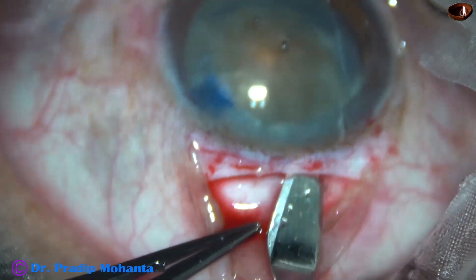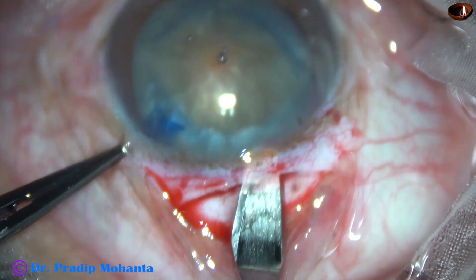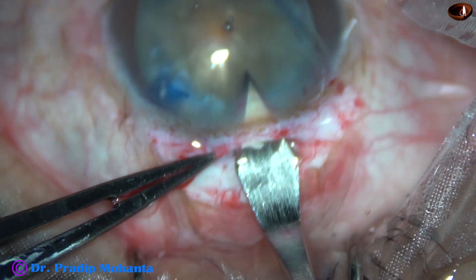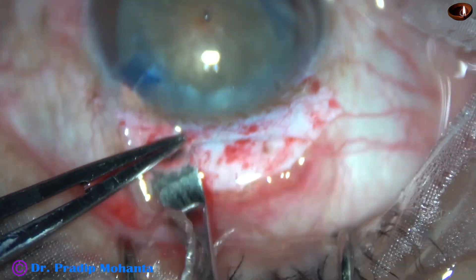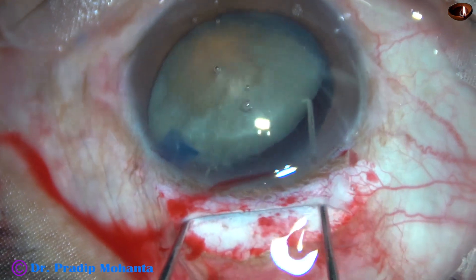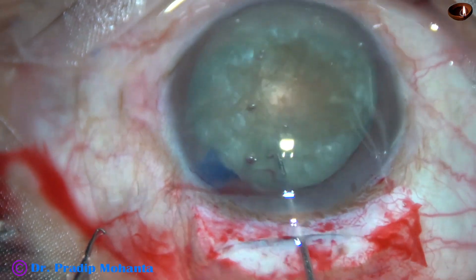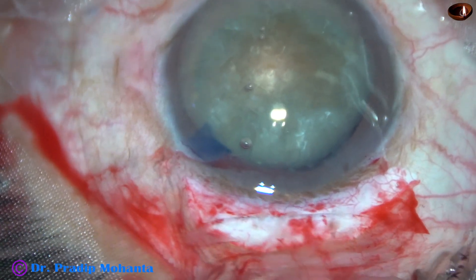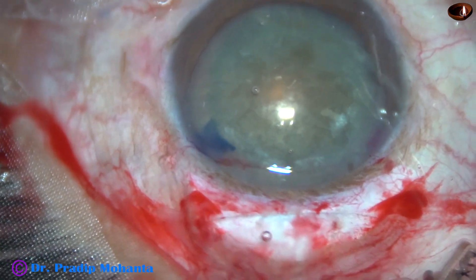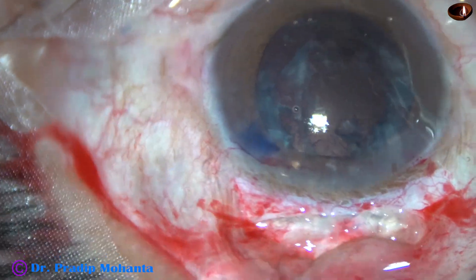Rhexis is already done, so we just have to prolapse the nucleus and deliver the nucleus. Whenever there is an extension or run-out of the rhexis, the tunnel is being opened. I usually prefer a visco-hook to deliver the nucleus. The nucleus is prolapsed, the visco-hook is made by just bending a 30-gauge needle — it goes behind the lens, turns, and hooks the nucleus out of the eye.